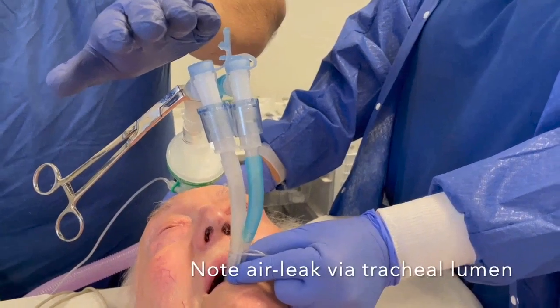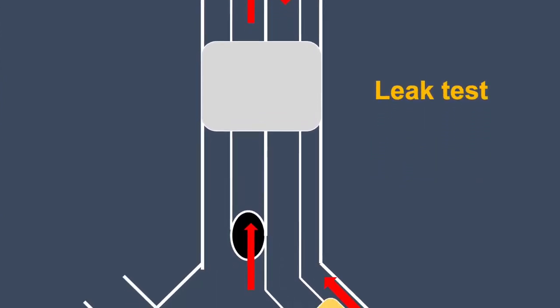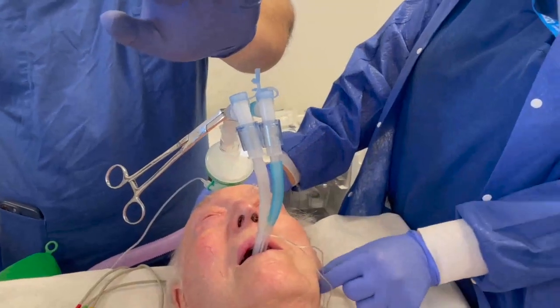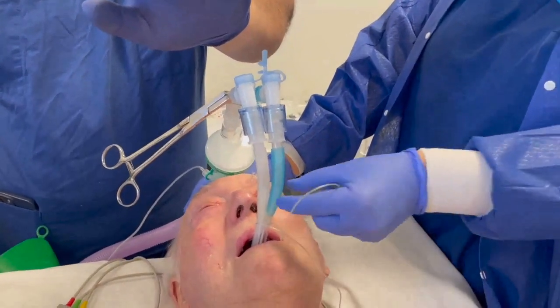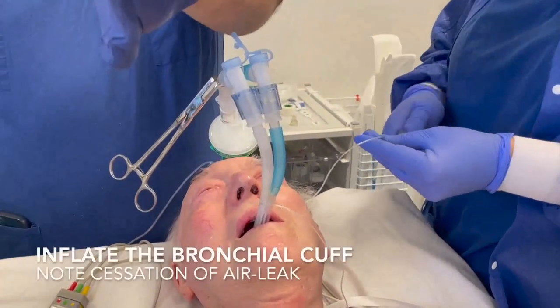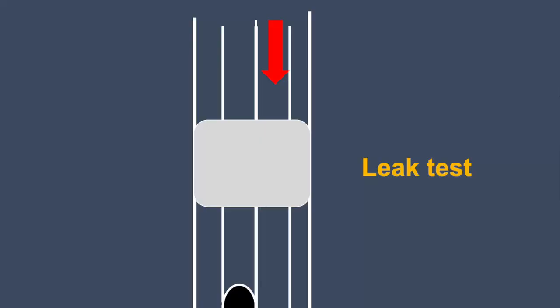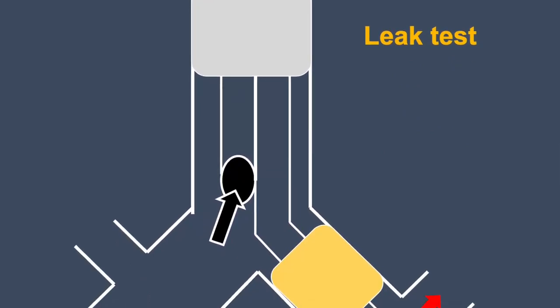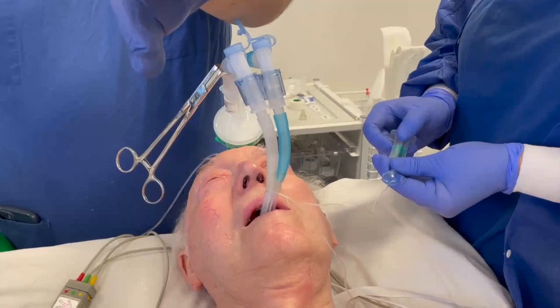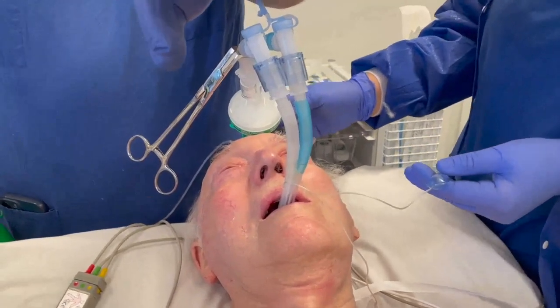Note the air leak felt at the tracheal lumen — air travels down the bronchial lumen and past the bronchial cuff back up the tracheal lumen. Now inflate the bronchial cuff with about 2ml of air; this should stop the air travelling up the tracheal lumen. If not, you may require a larger tube size. Note the clinical check is the only assessment for air leak on ventilation to predict effective lung isolation.